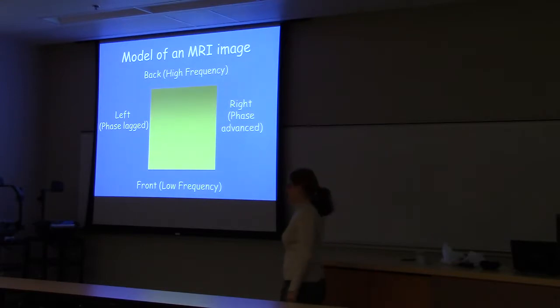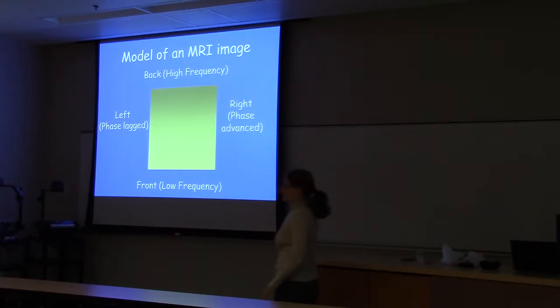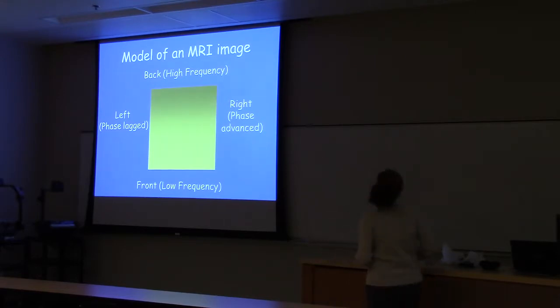What we could do then is put on a magnetic field gradient, say from front to back. The gradient is a linearly changing magnetic field. It's really a small change. So the field over here is a little bit lower, and the field over here is a little bit higher. Now the nuclei up front will sing at a lower frequency, and the nuclei at the back will sing at a higher frequency. So this slide alone is the subject of a 6-credit-hour graduate school course at Yale, but you guys only have a few minutes, so we're going to do it in a few minutes.